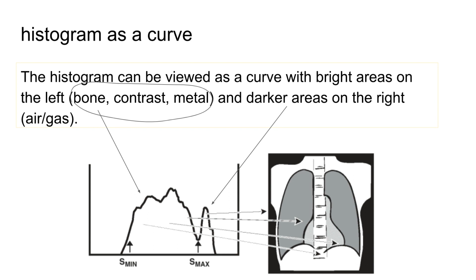It's not here, because in this particular example, you have a spike representing the raw radiation that's actually outside of the image.